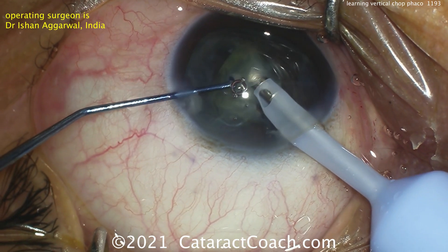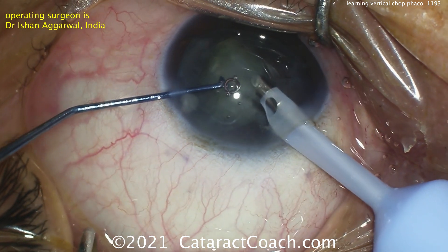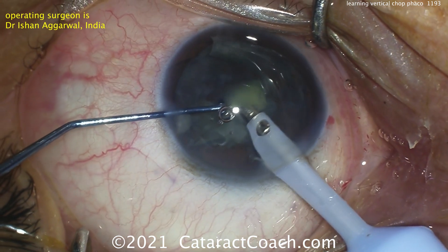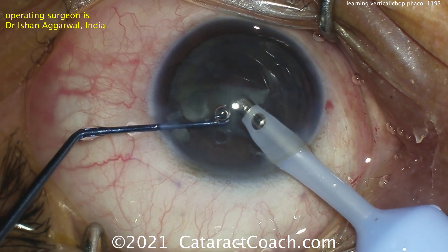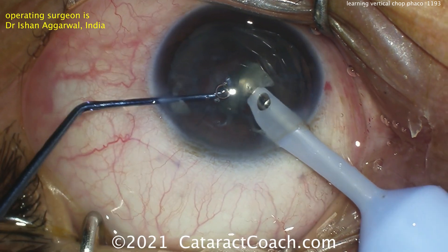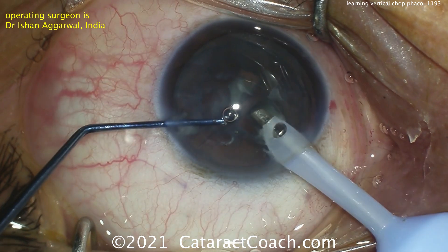You can still use this chopper for the rest of the case, just be careful — that tip is pretty sharp and it can damage the posterior capsule. Do you need any kind of special chopper to do it? No. You've seen me with my single chopper — I'll do any technique: horizontal, vertical, combo chop, whatever you want. The instruments are good, but I assure you the hands are more important than the instruments.